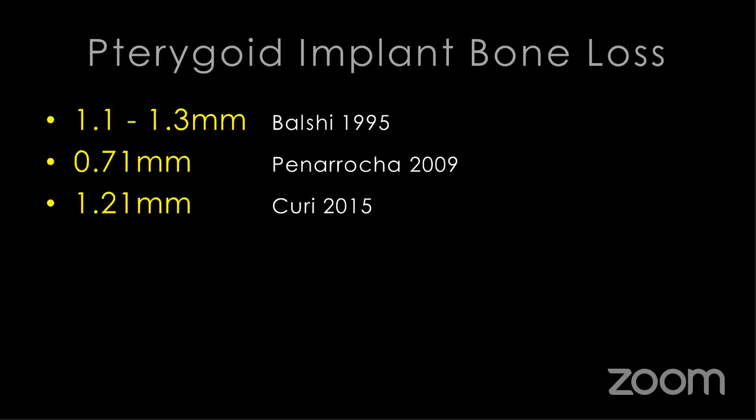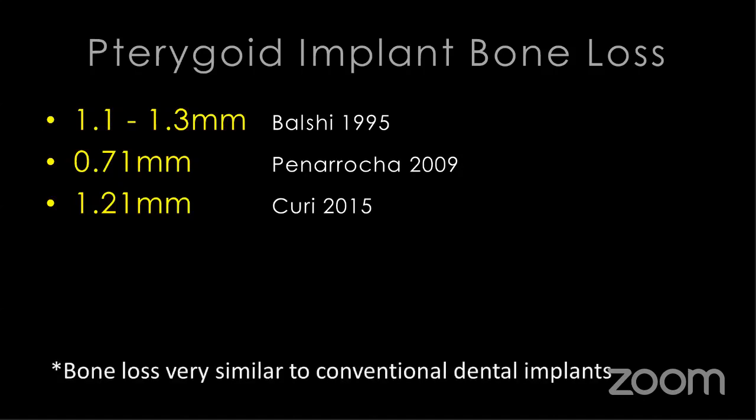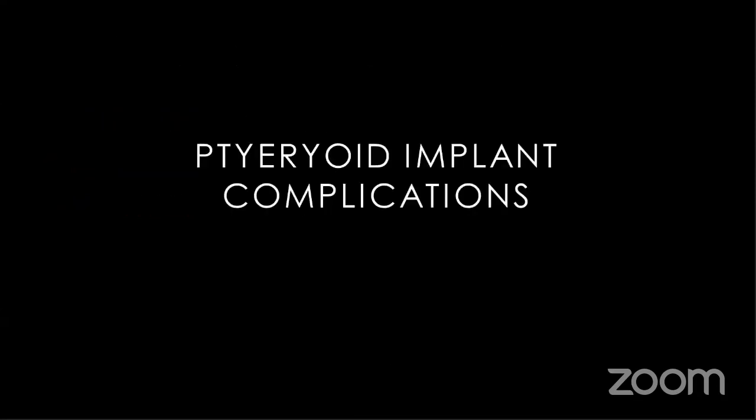There are a handful of articles that examine bone loss with pterygoid implants, and what we find is that the bone loss over time is very comparable to conventional dental implants. So we know that once they are healed, they remain very stable over time. So complications. What complications can we have with these implants? The typical complication reported in the literature is hemorrhaging, because we know we have a number of vital structures nearby. I can tell you that in the literature, there aren't any reports of any significant amounts of hemorrhaging.